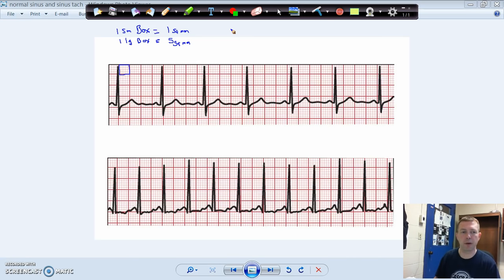The recording, when we make these recordings, the standard paper speed that we use is actually at 25 millimeters per second. But what that does is it allows us to convert each one of these boxes into a piece of unit time.